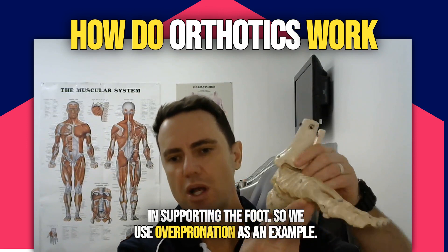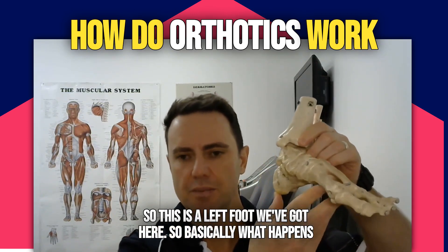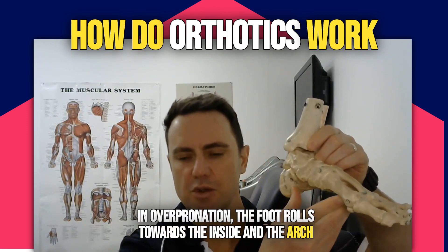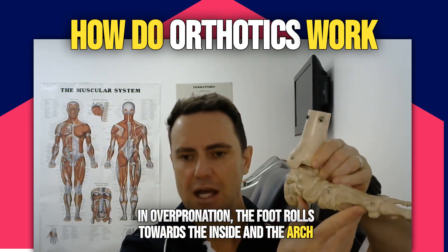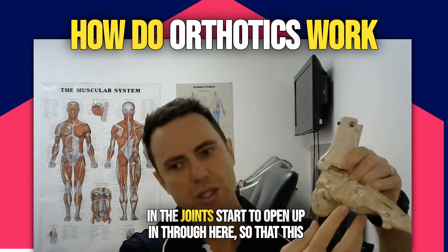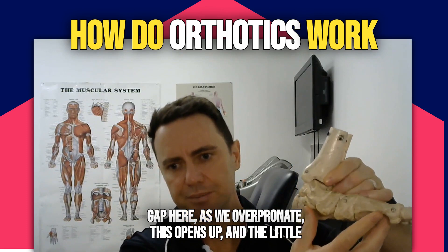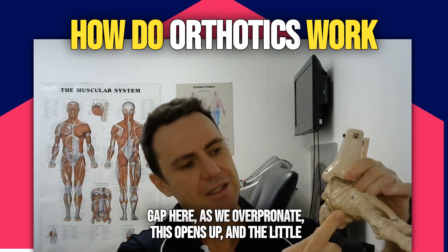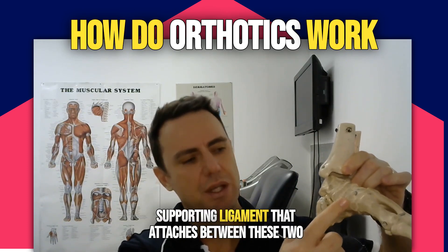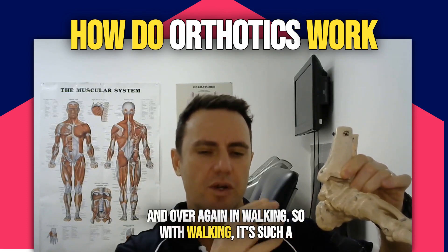We'll use overpronation as an example. This is our left foot here. What happens in overpronation is the foot rolls towards the inside and the arch flattens out. You can see immediately that the gaps in the joints start to open up through here. As we overpronate, this gap opens up and the little supporting ligament that attaches between these two joints will actually get strained as we load it over and over again in walking.